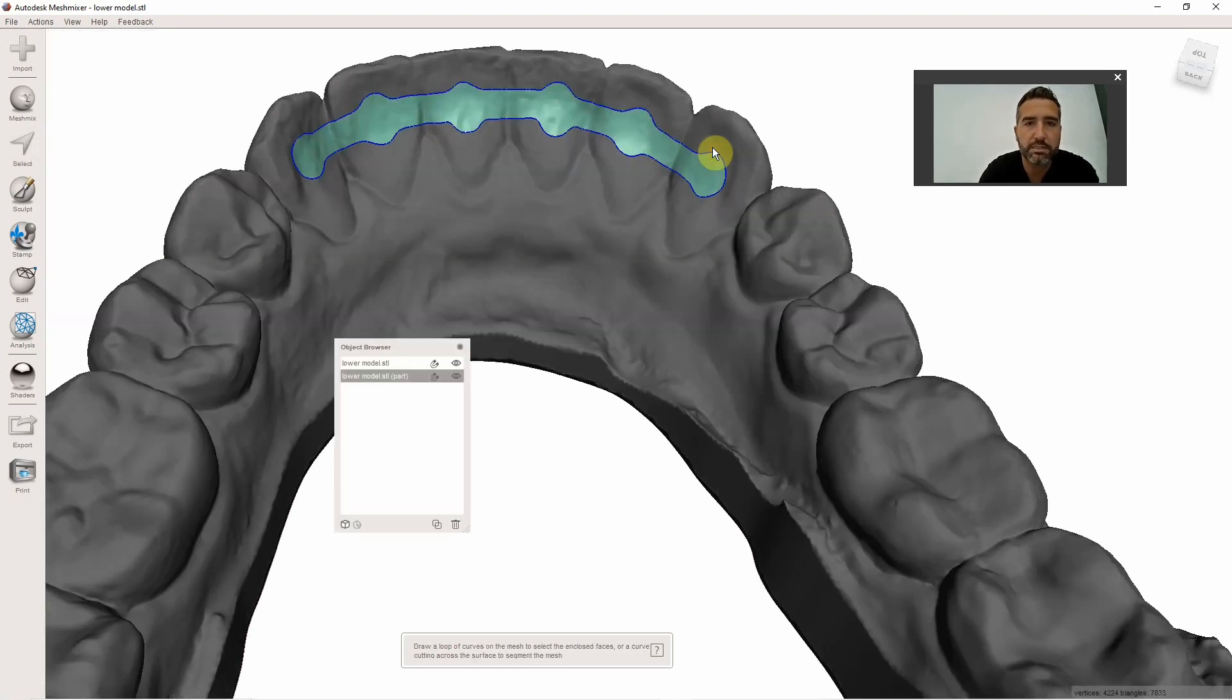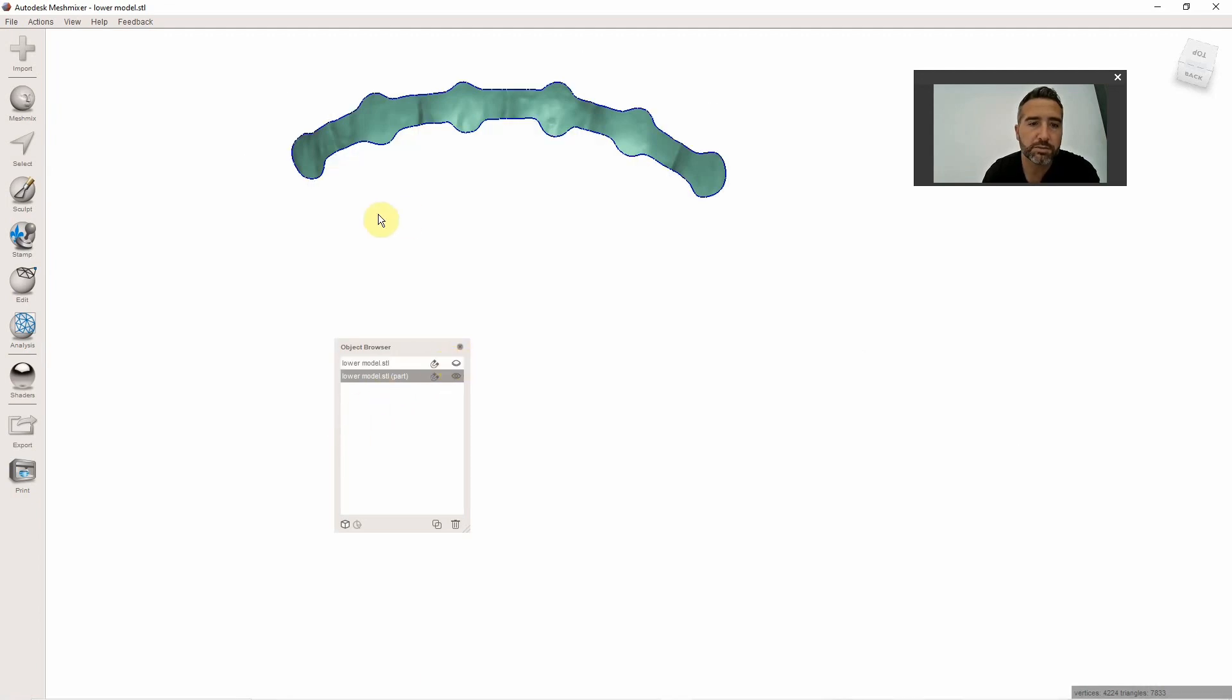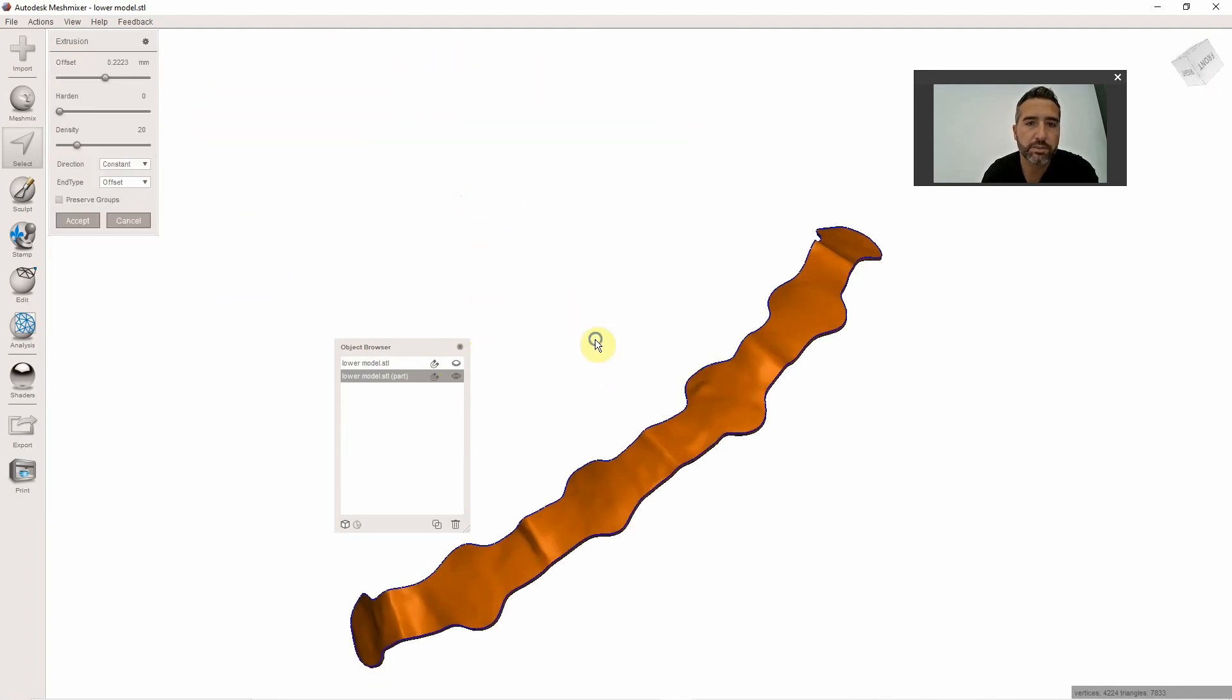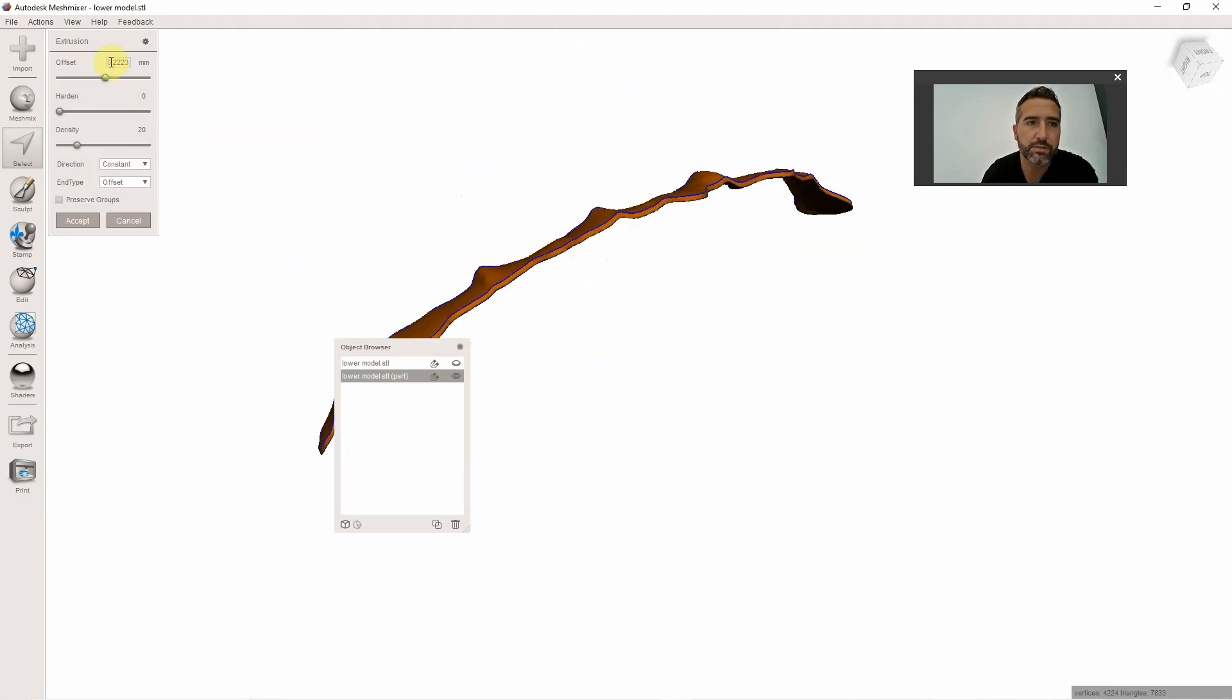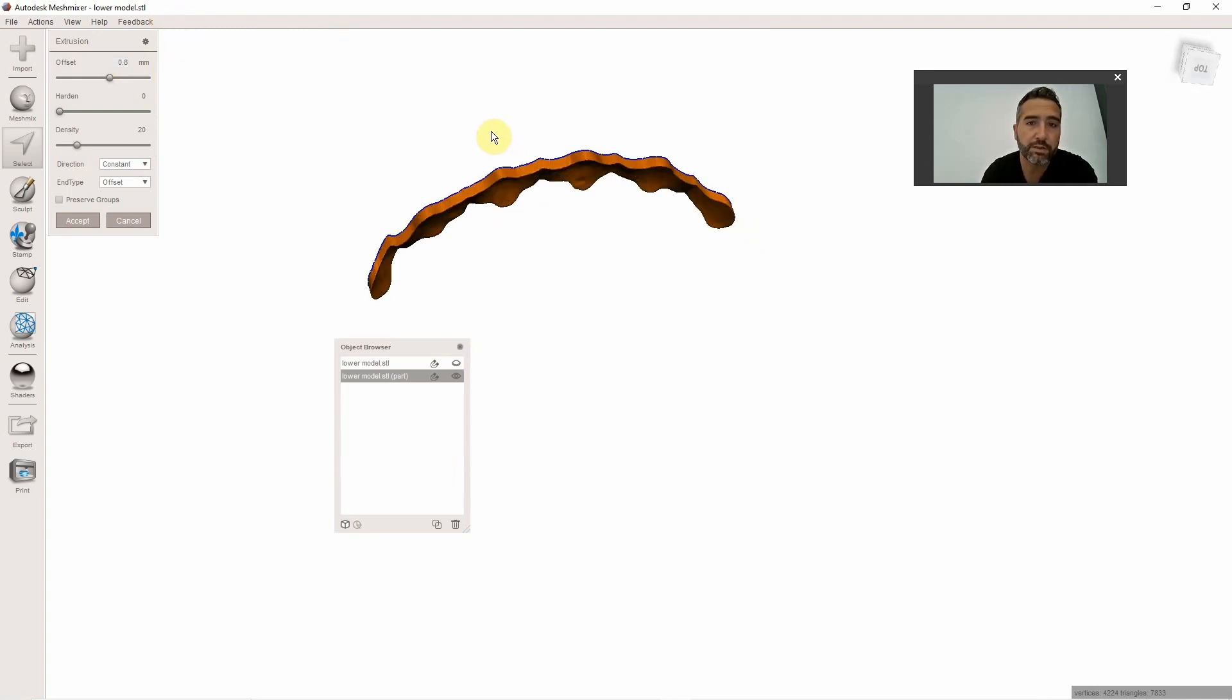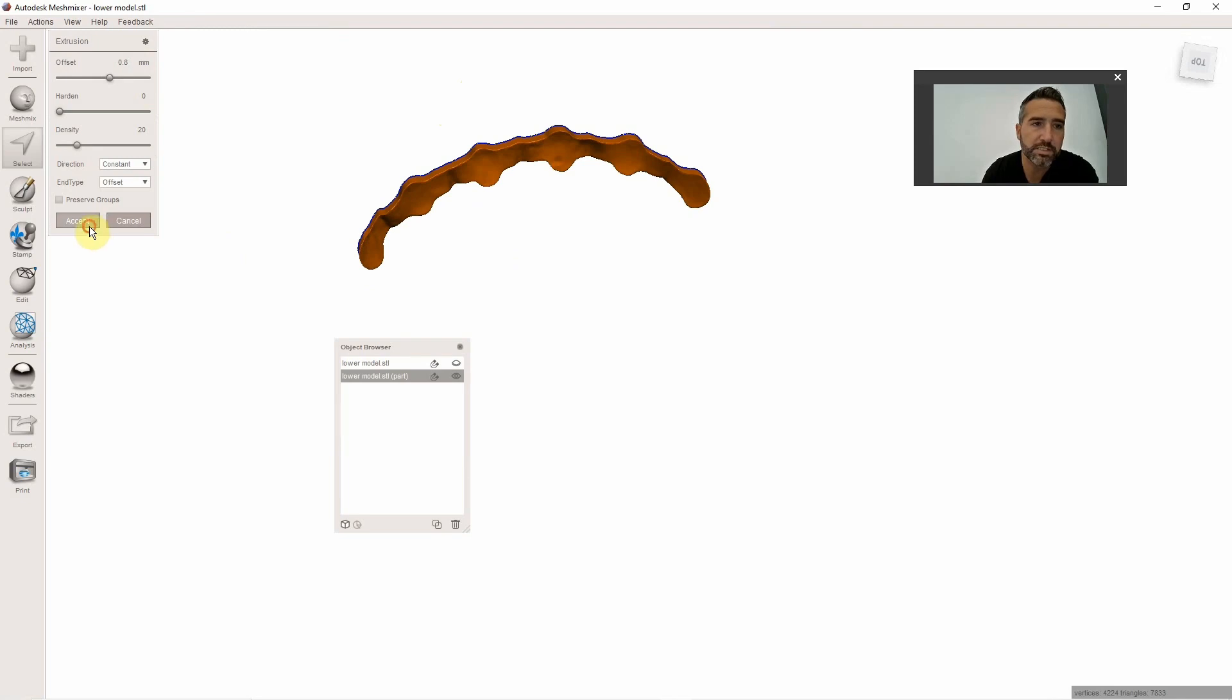Hit Y as in yellow to make that its own file. What you're going to do is hit Control-A to select the whole thing. You're going to hit D as in dog. That's going to extrude that surface. 0.8 millimeters is what I usually go for. This is personal preference. I've gone thinner than that for sure. You're going to hit Accept.